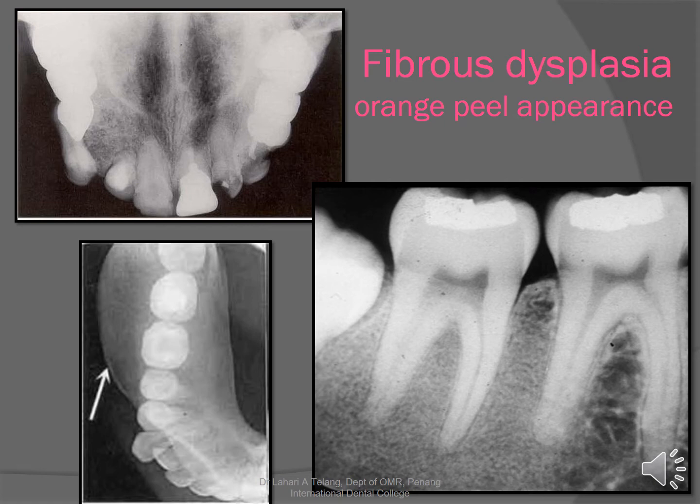In the mandibular occlusal view here, you will notice that there is expansion. The white arrow is pointing towards buccolingual expansion of the bone. Similarly, in the mandibular molar image, you can very clearly demarcate that in the furcation of the mandibular first molar the marrow spaces are wider, and that is normal bone, whereas from the distal root of the first molar onwards, extending towards the 7 and the 8, the trabecular pattern has changed.